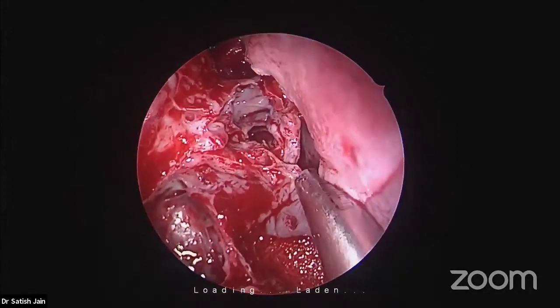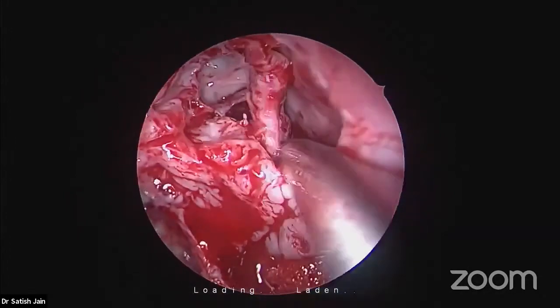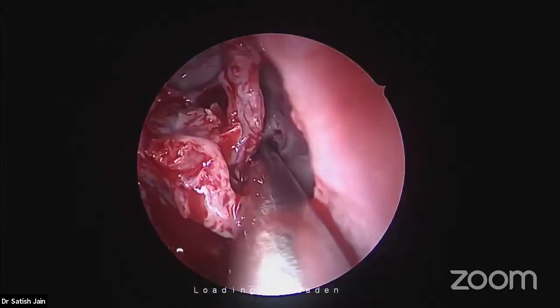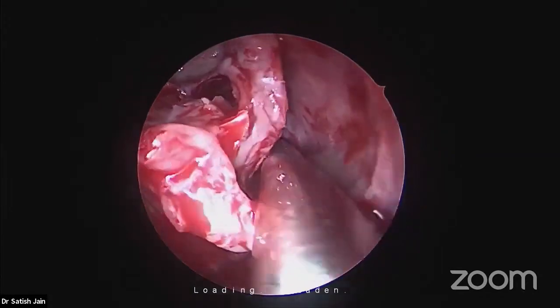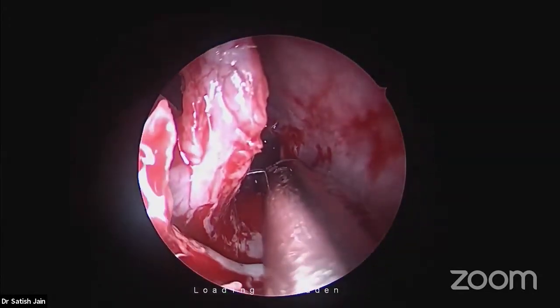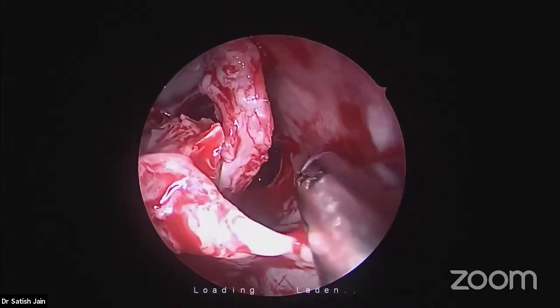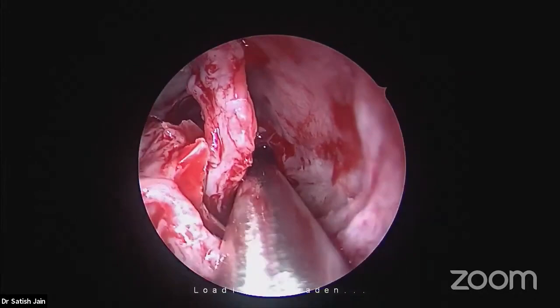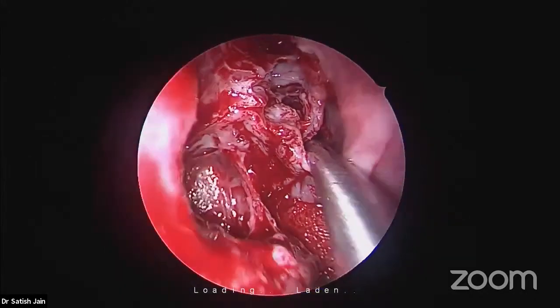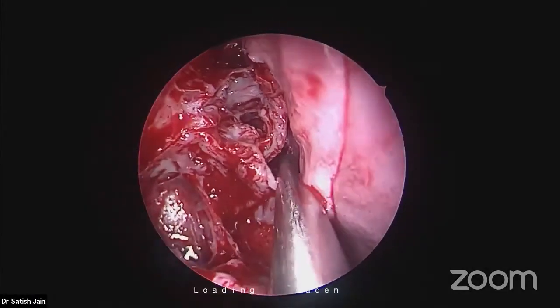So always take this line into consideration. See this line here? Stay close to the septum, not close to the turbinate. Close to the septum, and this is your sphenoid opening. Mind it, what I'm saying: close to the septum, not close to the turbinate. Flush to the septum at the level of what? The maxillary line. Can you see?